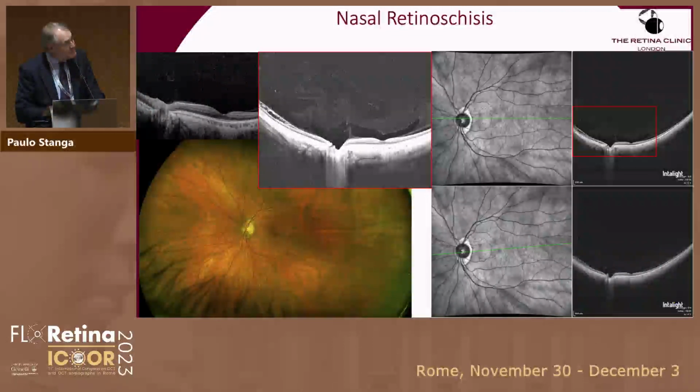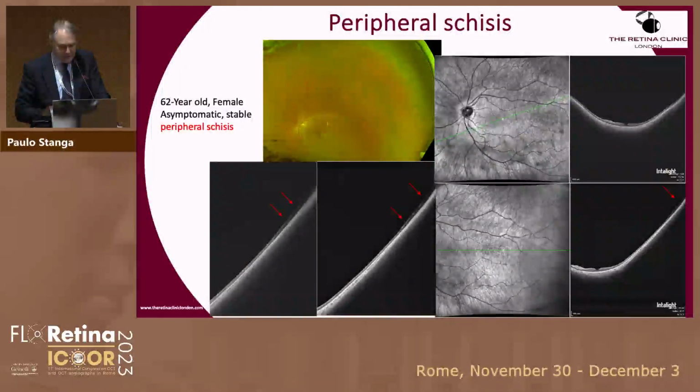You can clearly see the space of Martegiani, the spurs, the bursa premacularis, and the system of cisterns. This is an enhanced visualization of the vitreous obtained with this device. This is peripheral schisis. Again, very useful when you want to differentiate peripheral schisis from peripheral retinal detachment.